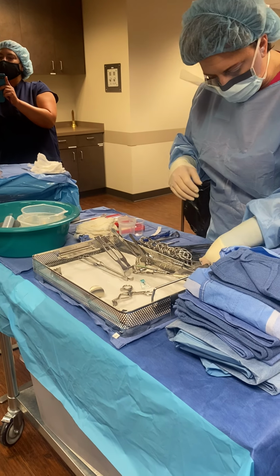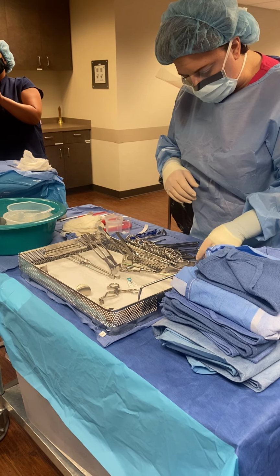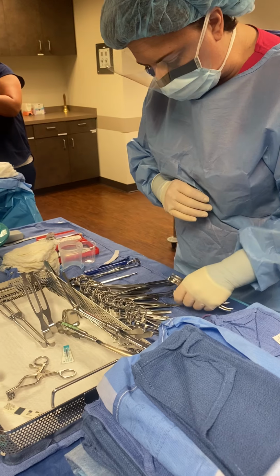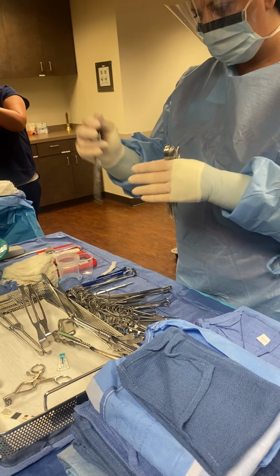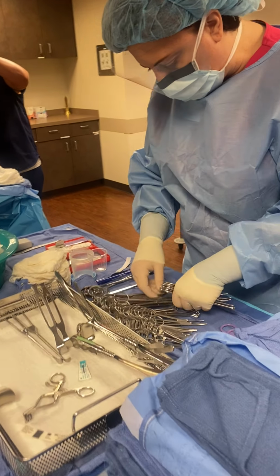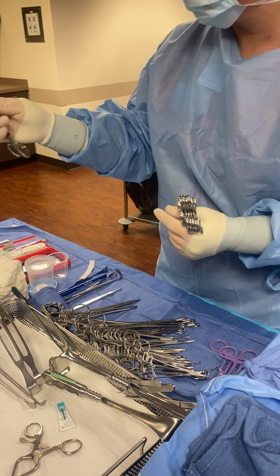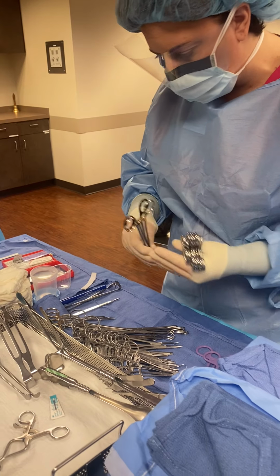And now I'm going to decide what instruments I would like. For a breast biopsy, it's pretty simple. Probably a couple of mosquitoes. You want to bring clamps up two at a time. A couple of hemostats, curved hemostats. Alice's are good for grasping the mass. Sometimes you'll see Leahy's. We're going to put a couple of Alice's up there. Really don't need sponge sticks for this. A fine scissor, so I'm going to put the Metzenbaums up there. She's going to be stitching, so I need the suture scissor. And then a couple of needle holders.